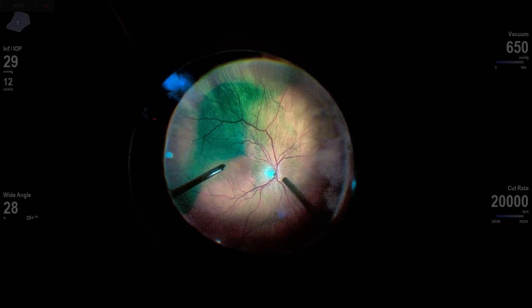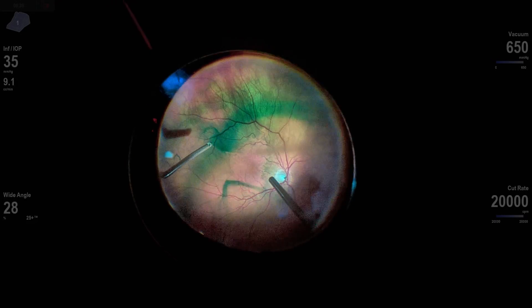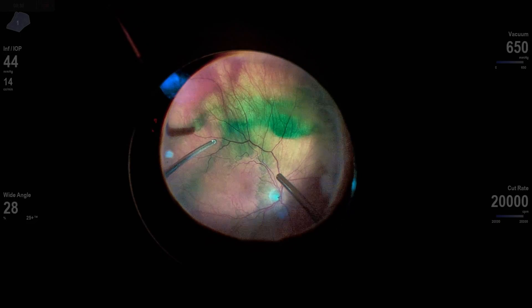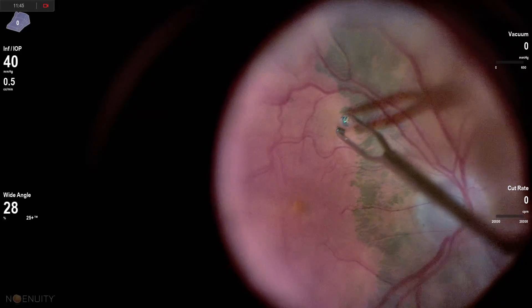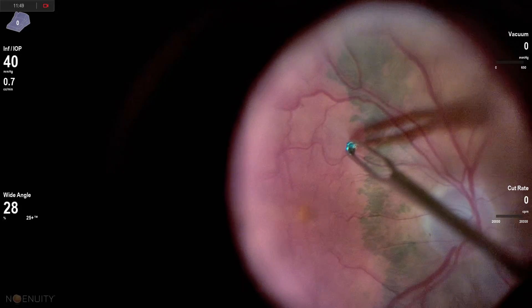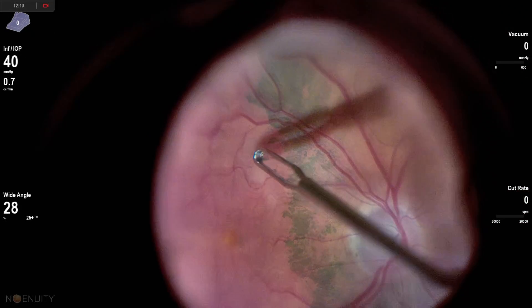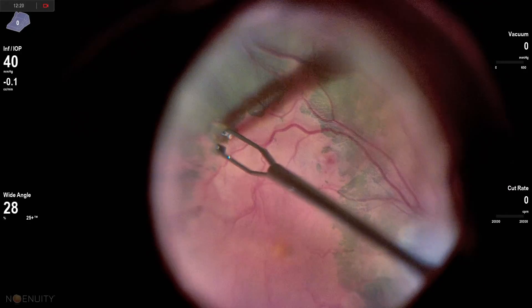Here you can see I'm putting in the ICG. I'm going to remove that from the fluid fill. I mix the ICG with D5W — it creates a heavy ICG that settles onto the macula. After completing that, we can see we have negative staining of the epiretinal membrane. The ICG stains the internal limiting membrane around the epiretinal membrane but can't stain the ILM under it, which allows us to identify where the epiretinal membrane is.